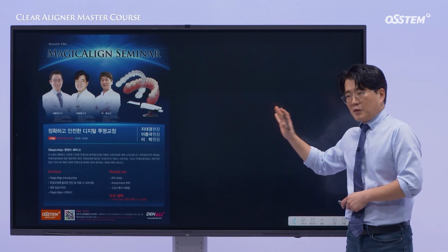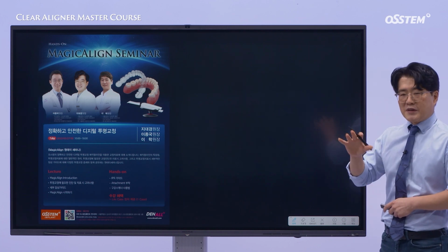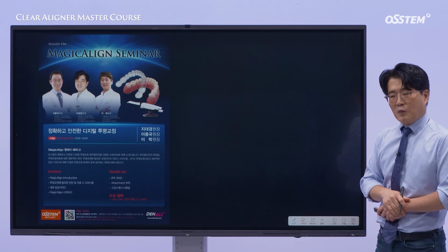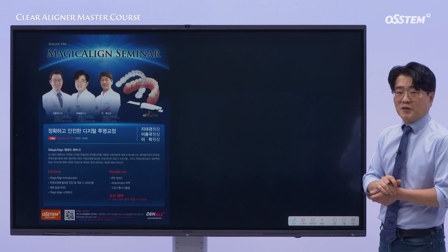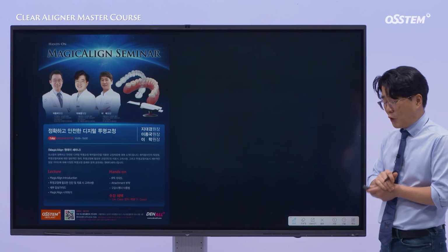Today, after briefly explaining Class 1 crowding cases, I looked into spacing cases. For orthodontists, they can be very simple cases, but for GPs, they can be challenging, but still worth trying.